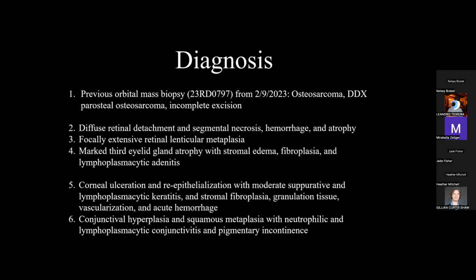The corneal and conjunctival changes could have been caused by the radiation, but we also couldn't rule out a degree of exposure keratopathy or secondary changes from the decreased function, possibly from the third eyelid gland, from the changes from radiation. So there's a little bit of that going on as well. Okay.